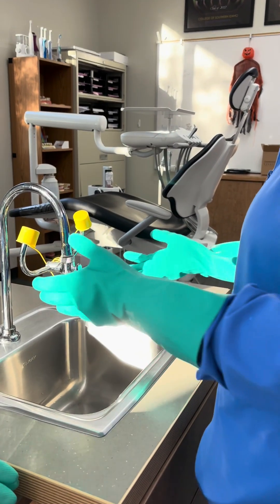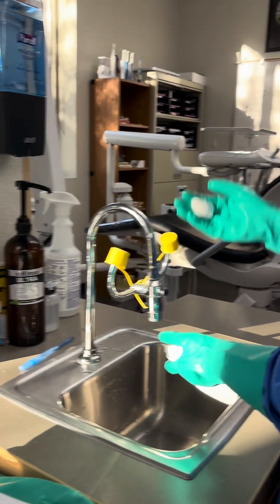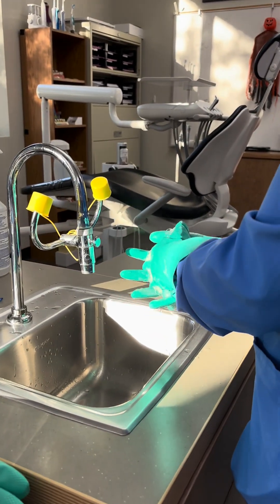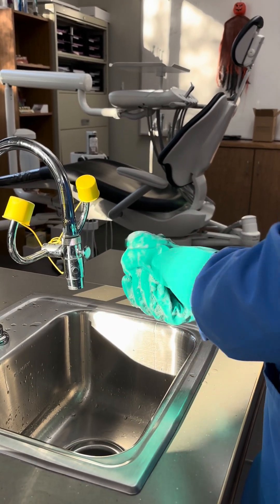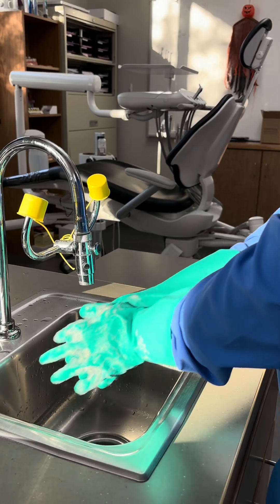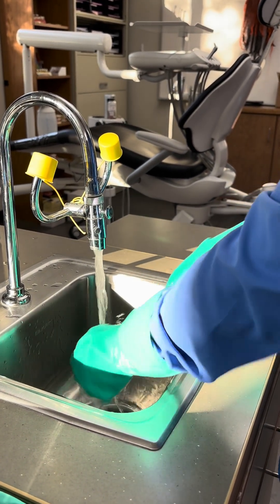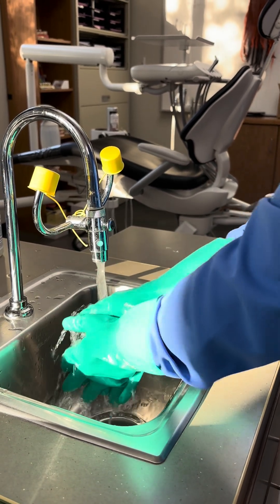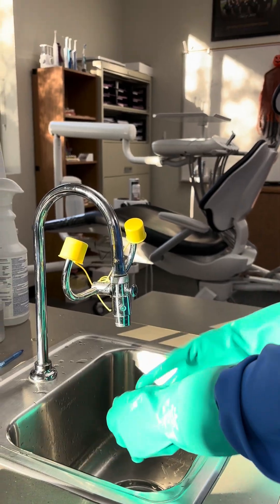Now we're going to wash the utility gloves with hand rub or soap — we're going to use soap in this situation — to completely disinfect them before we do anything else. And then we're going to dry them.